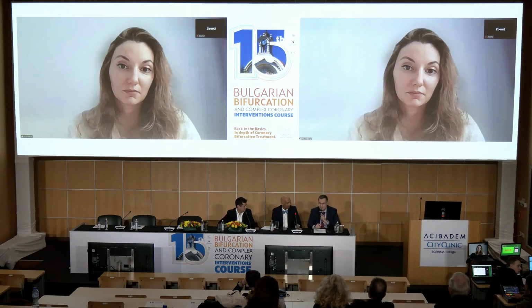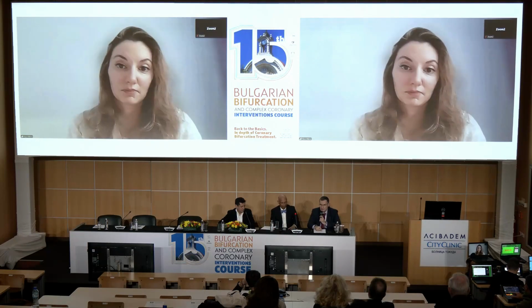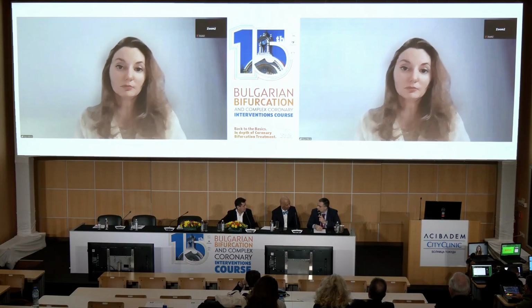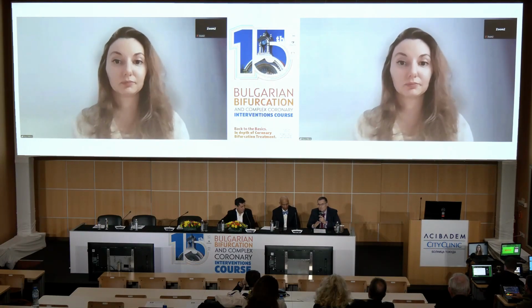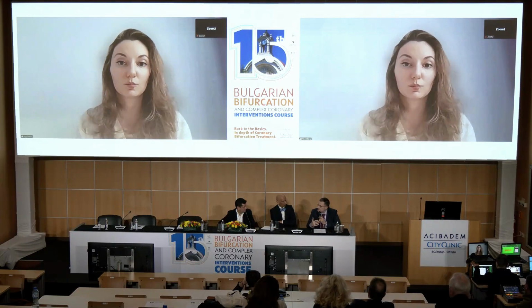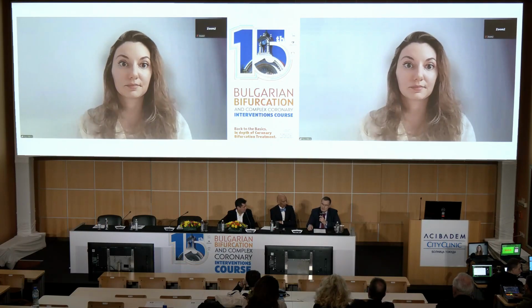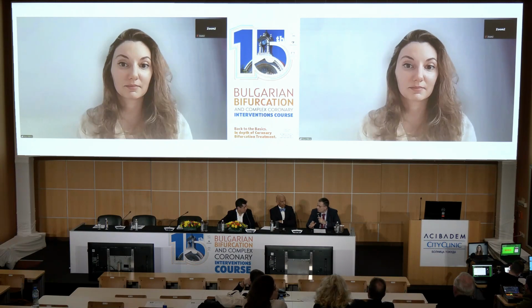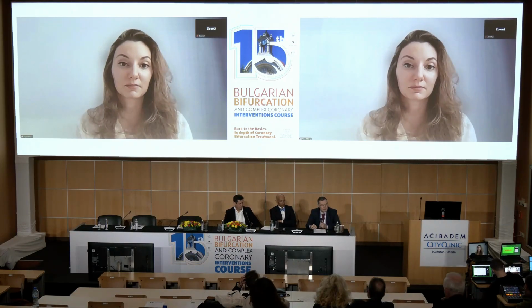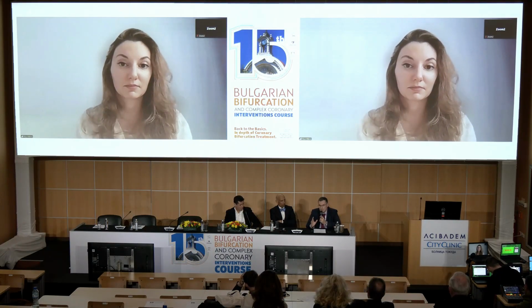Yes. We have quite a good number of cases. We demonstrated in Warsaw a case with a CTO, which was very interesting because there were stents implanted in a very interesting way, and practically CT is the best for me for planning just beforehand, to know where the vessels go. For planning, just to have a clear image of what you have to deal with.